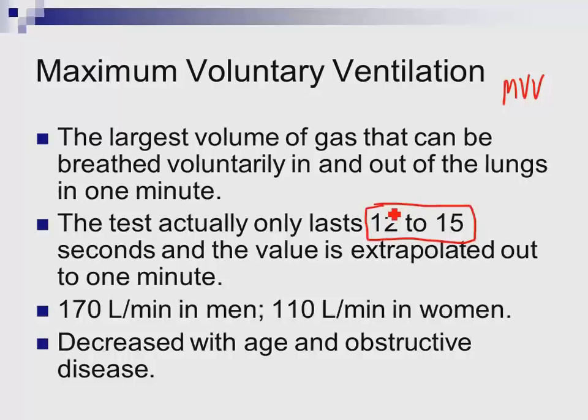Try getting an 82-year-old to do that. It becomes very difficult. But it's a good index of how much capacity they would have if stressed. If you're being chased by a lion down the street, how much could you maximally do? That's kind of the idea behind it. And it only lasts, like I said, 12 to 15 seconds because we pass out. And I have had patients pass out doing it because they get so lightheaded.